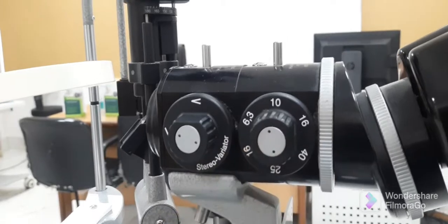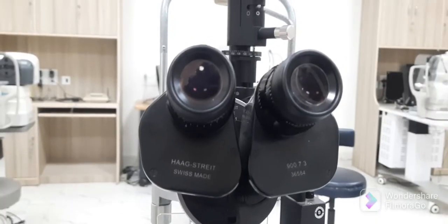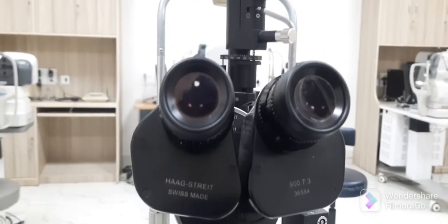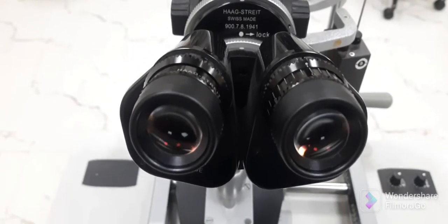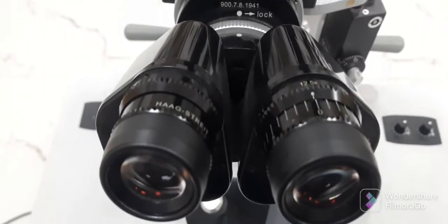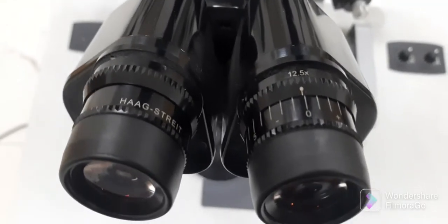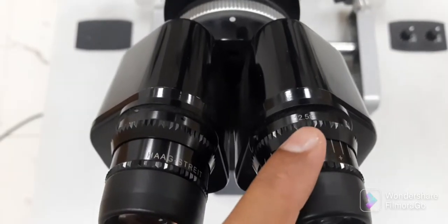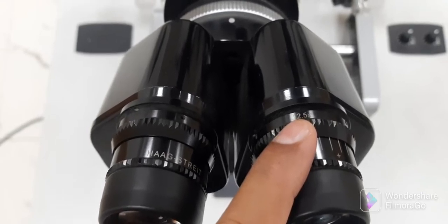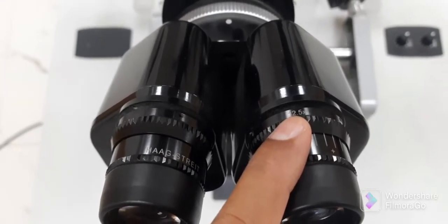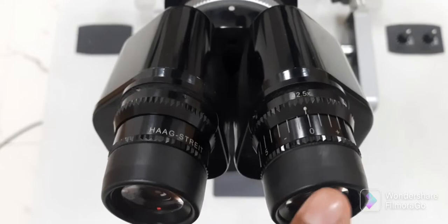Now the next step is to focus both eyepieces through which patient's eye is observed by the examiner. The eyepiece provides 12.5x magnification. These are the two eyepieces - this is the left one and this is the right one.